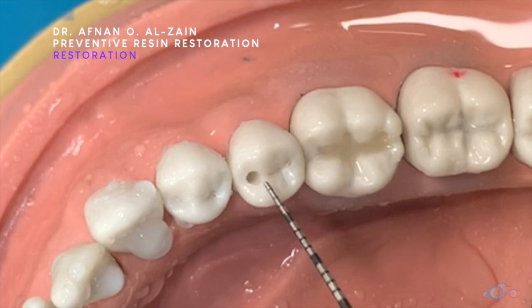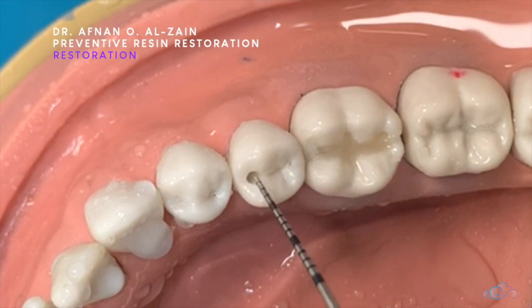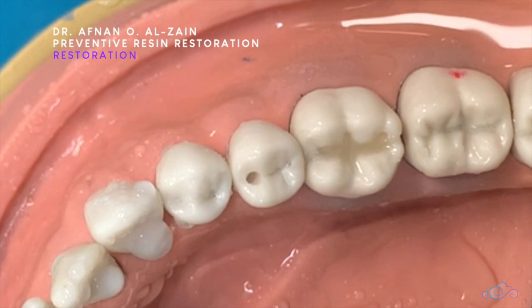We're going to apply bonding in this pit, then apply composite and cure it. In the rest of the grooves, we're going to apply the fissure sealant. So the first step is acid etch.